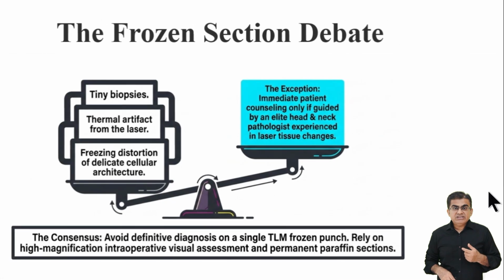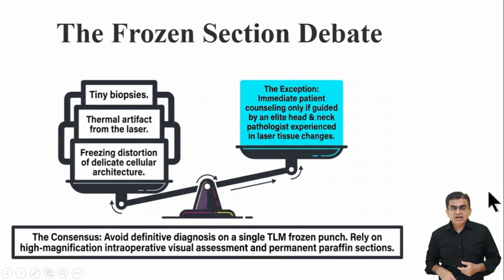Let us now discuss a major controversy with regard to frozen section in TLM surgery. Look at the balance scale on your screen representing the frozen section debate. In traditional open surgical oncology, frozen sections are the absolute gold standard to guarantee clear margins. But in transoral laser surgery, we face these three distinct problems.